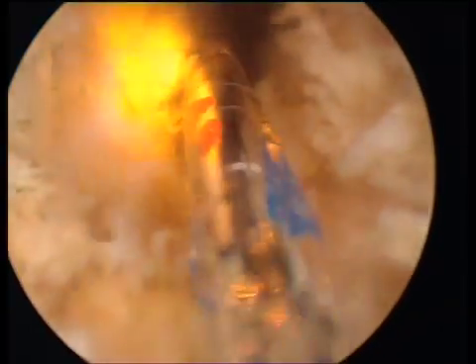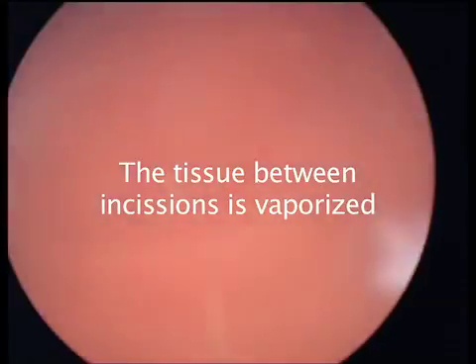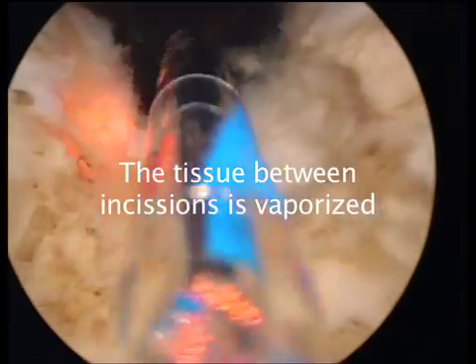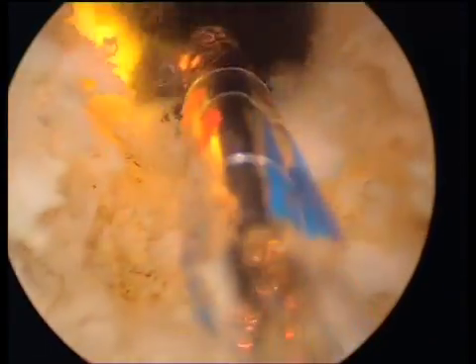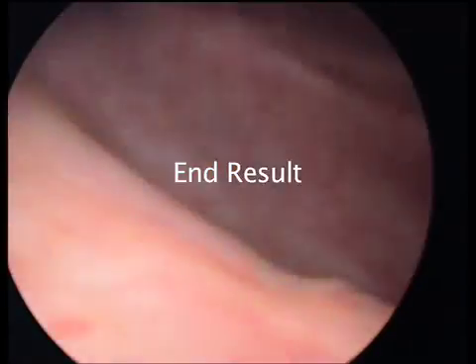Then the tissue between the lateral incision and the midline incision is vaporized, leaving a round and very satisfactory prostatic fossa after the procedure.